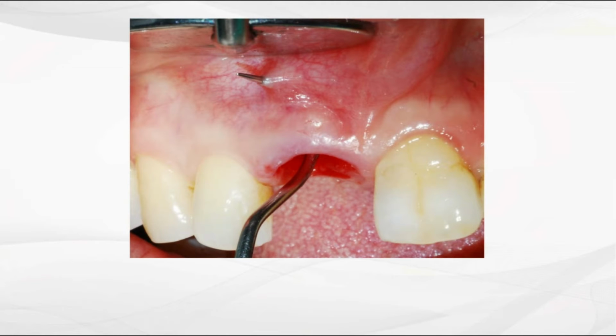Considerations when establishing treatment plans are: first, if we do extraction, immediate implant placement, and socket preservation simultaneously, it would be most likely to cause inflammation due to movement and resorption of the fractured segment. And when the flap is open, the fracture pieces does not unite as shown in the picture. Can you see the soft tissue perforation from the socket here? Yes, the fractured segment must be removed in that case. Loss of the labial contour is highly expected, which is disadvantageous to the anterior aesthetics.